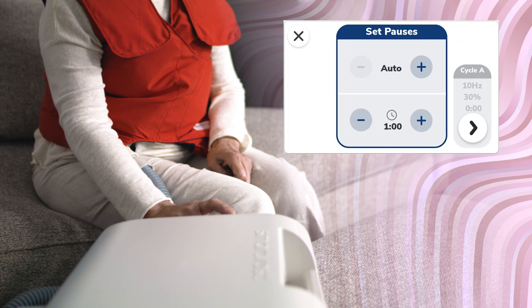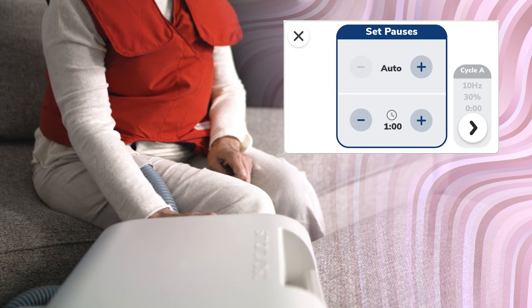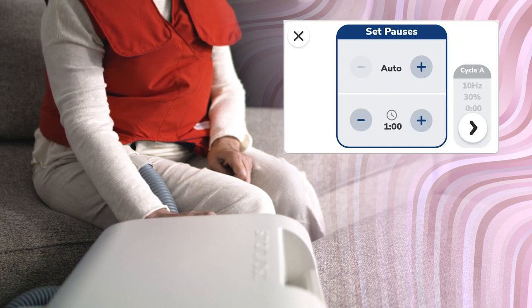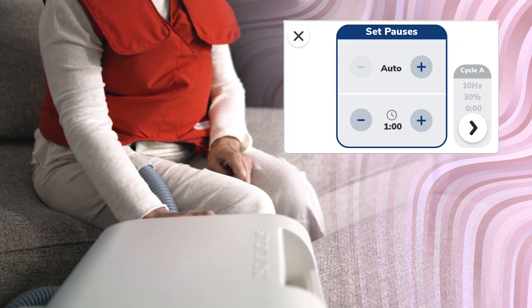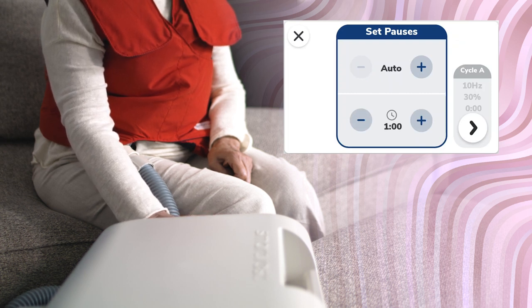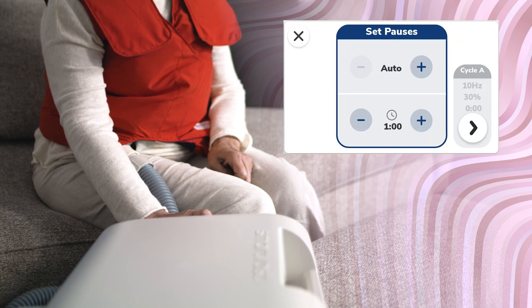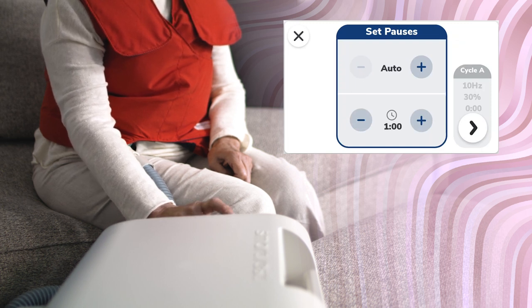The generator is designed to offer breaks in the therapy session. These pauses are designated to clear secretions. The number of pauses and their duration can be customized to each therapy. Utilizing the auto-pause setting will add a pause at the end of each completed cycle.